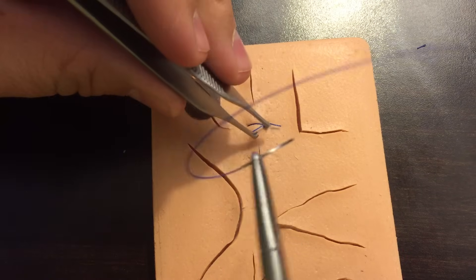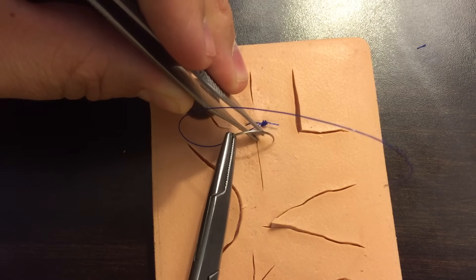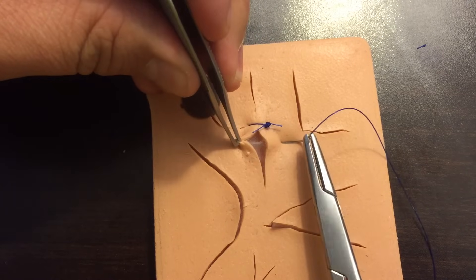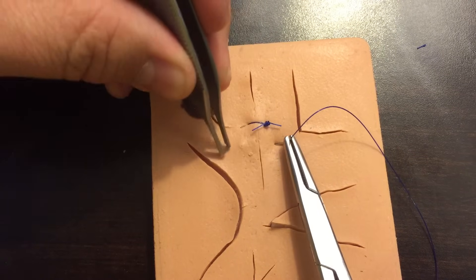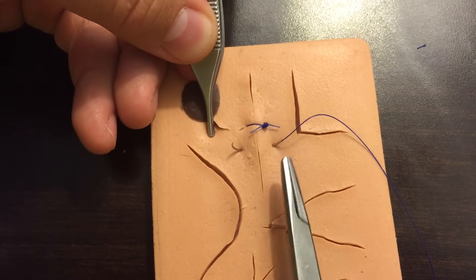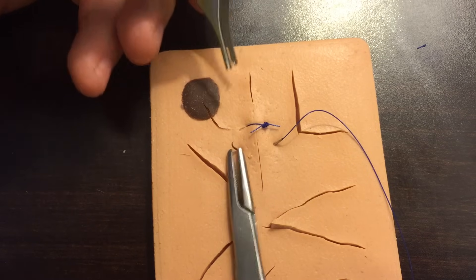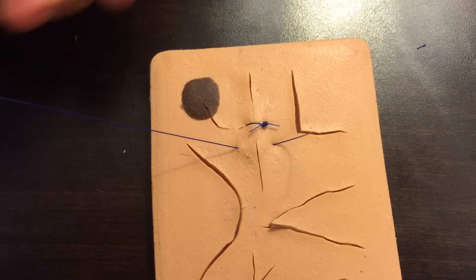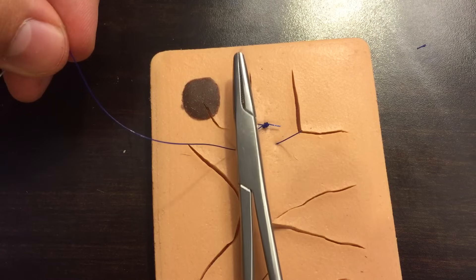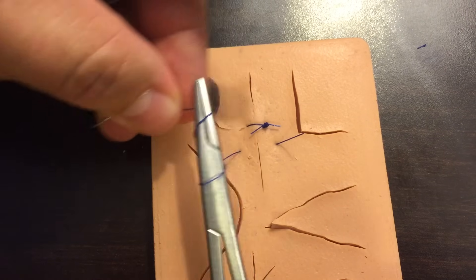For the next suture — much faster, less talking. Enter at 90 degrees with good depth, enter the other side at the same depth, push down so the needle exits at a 90-degree angle. The distance from the wound edge on both sides should be equidistant. Pull the suture through and set up the instrument tie.